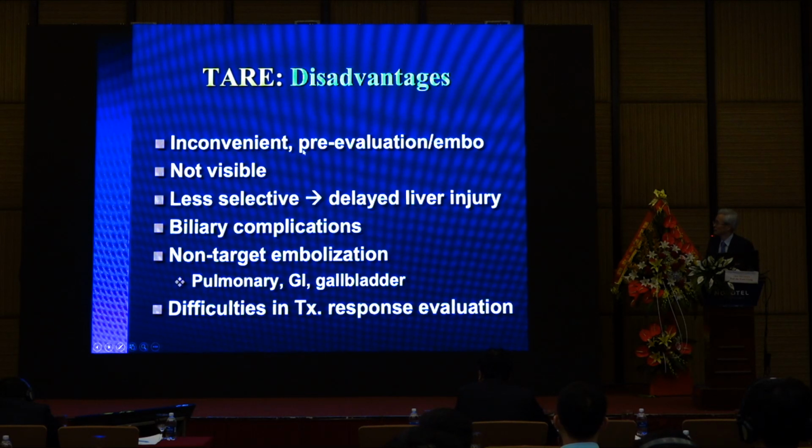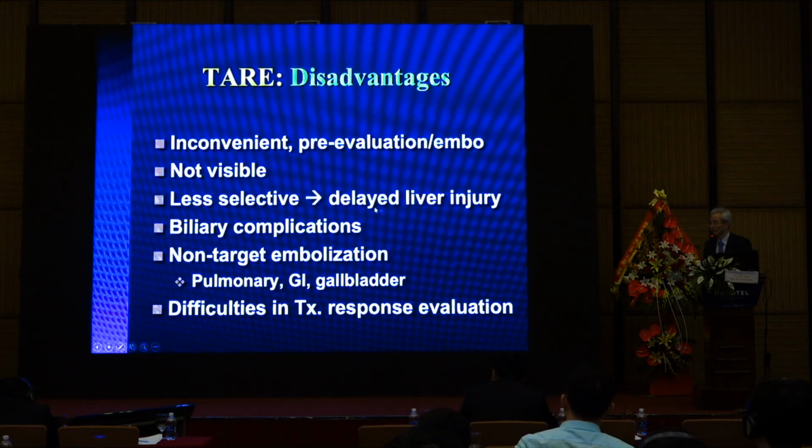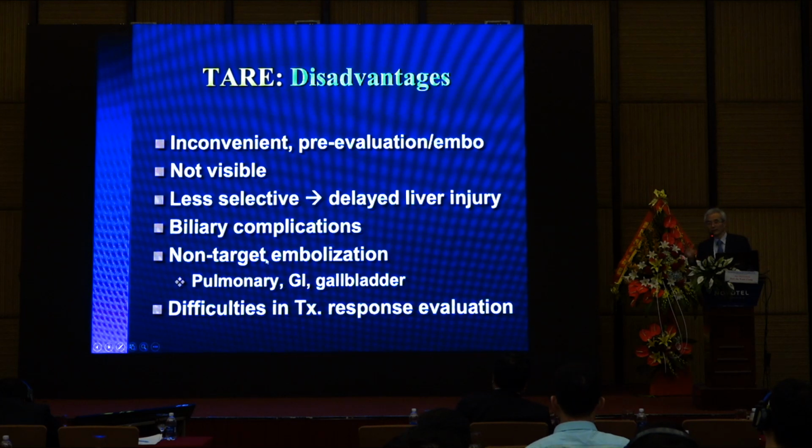Disadvantages are that it is inconvenient, pre-evaluation is needed, it is not visible, it is not comfortable for IR doctors, and it is a less selective procedure, so there is a higher chance of delayed liver injury. If non-target embolism occurs, it causes a very severe complication.